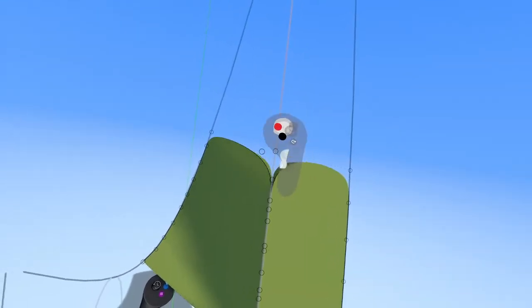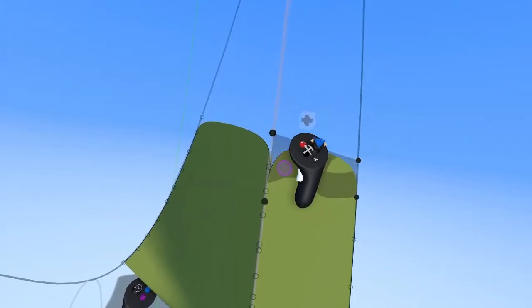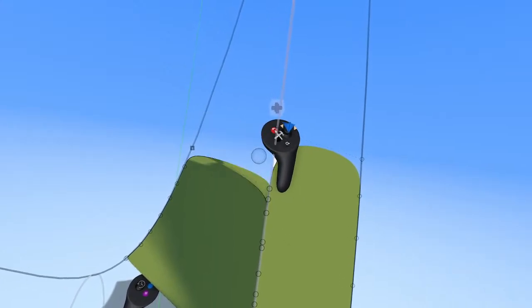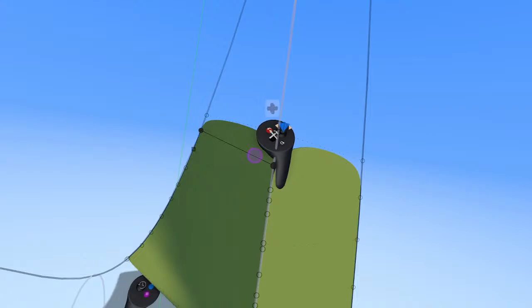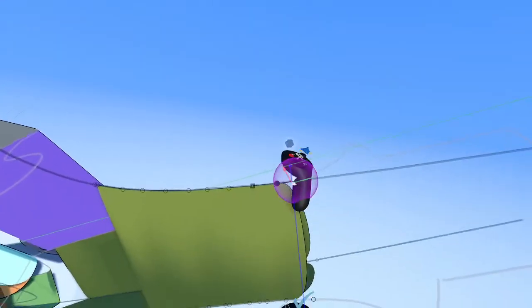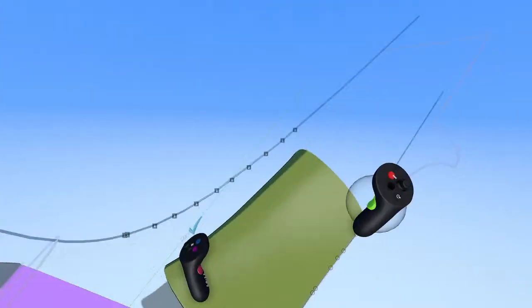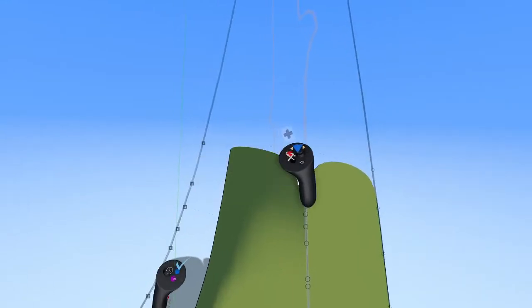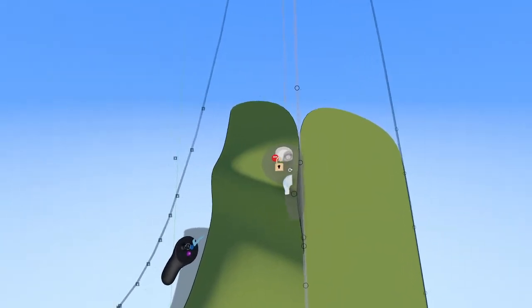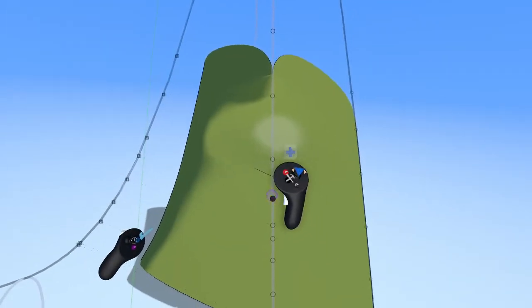And so we'll take this dot here for that surface, this dot here for this surface, connect them together, and we'll do the same thing. Sorry, one second. I'm just going to connect it across the mirror plane. All right, here we go. Same thing down here. And if you have extra edit points like this, just grab the edge, hold it, press the red button, and delete it.